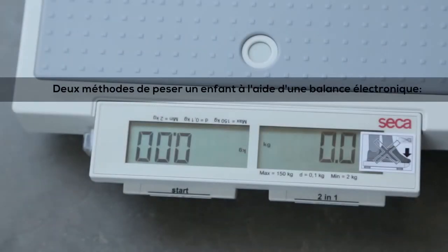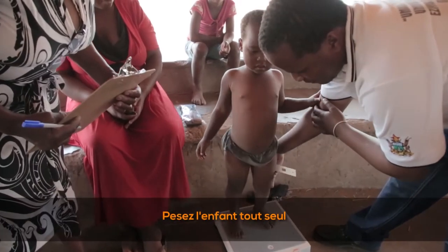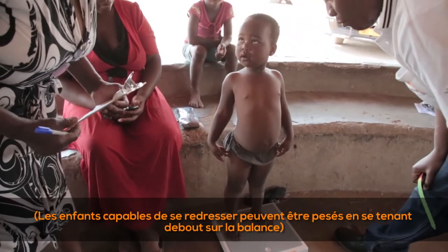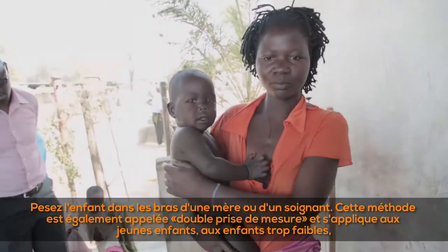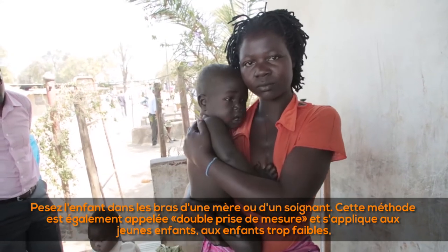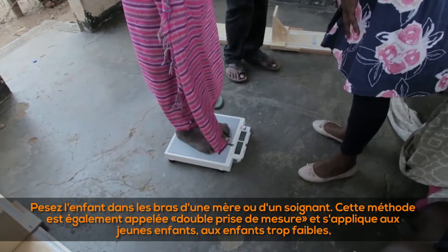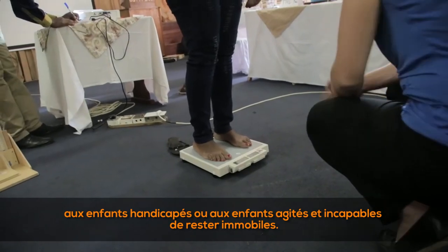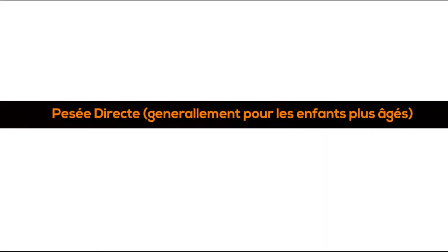There are two methods of measuring a child using an electronic scale. One: direct — the child is measured by themselves; children able to stand up can be weighed by standing on the scale. Two: indirect — holding the child in the arms of a mother or caregiver, also referred to as double weighing. This applies for young children, children who are too weak, disabled, or restless and cannot stand still on their own.